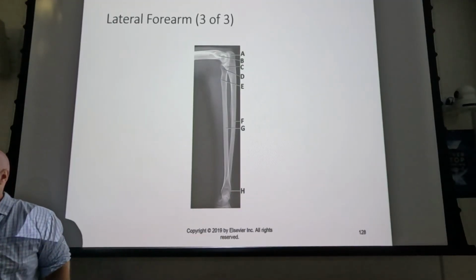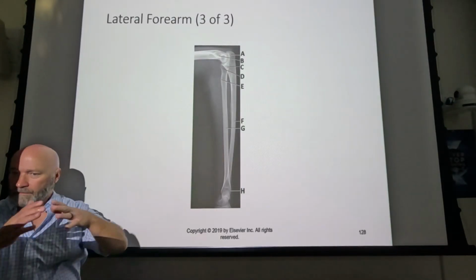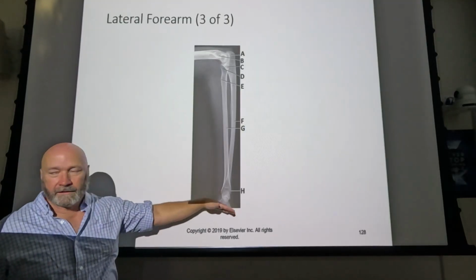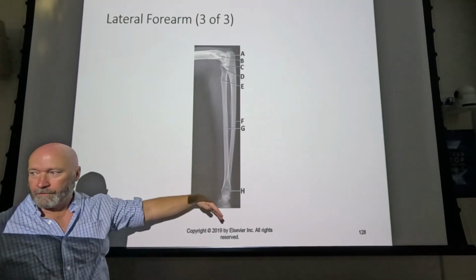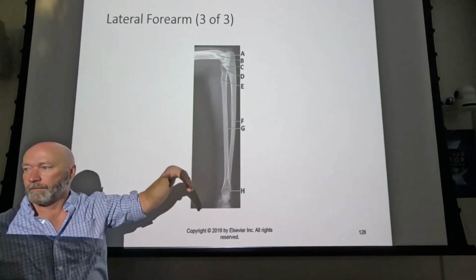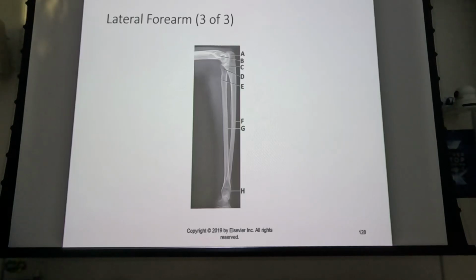And that's a legitimate reason to order all three, because that bone is so long, you get so much divergence of the central ray that you get an ugly image of both the elbow and the wrist bones. So you've got to shoot all three: elbow, forearm, and wrist. Okay. Is there a reason to shoot finger and hand separately? No, there really isn't. But some of your docs are going to order that.